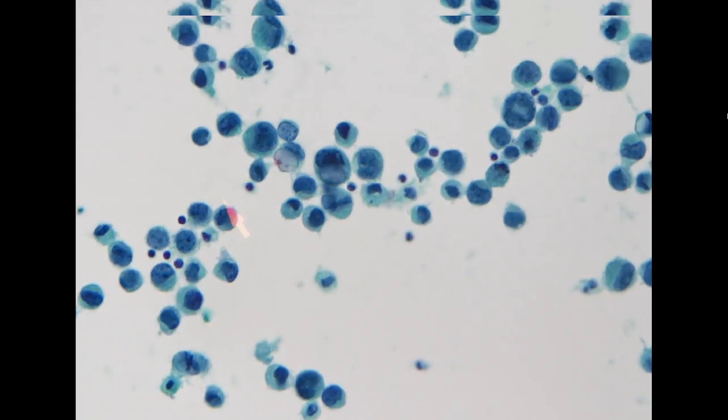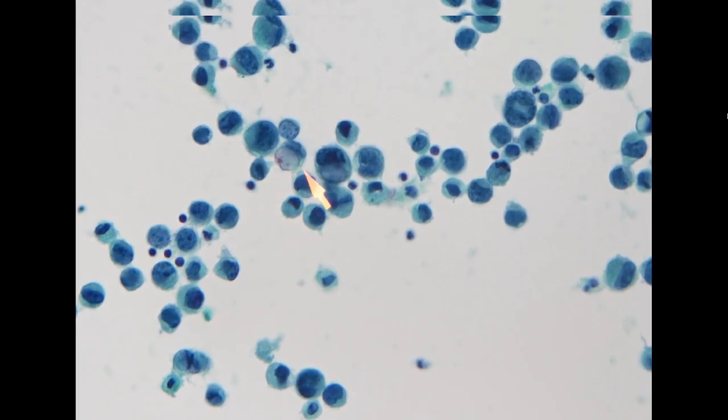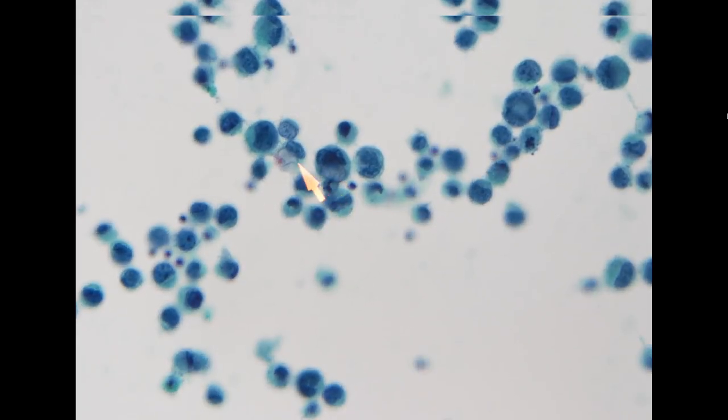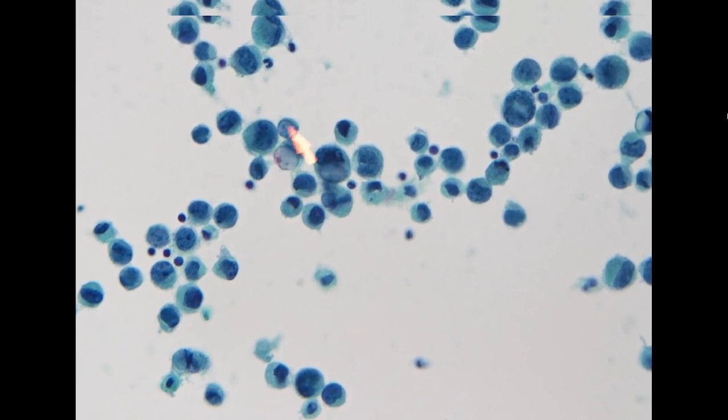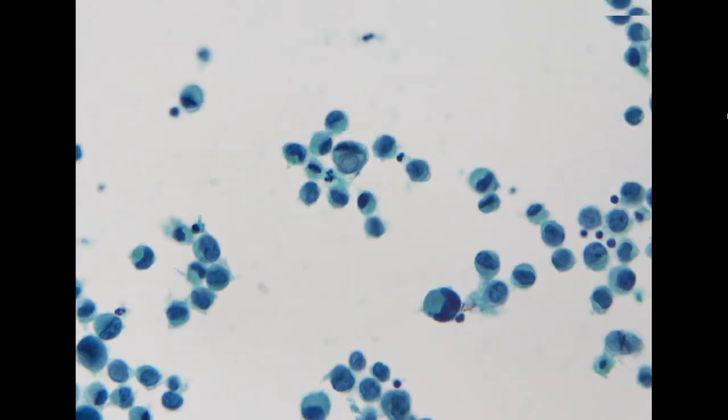So for the gastric signet ring cell carcinoma, usually it would present as individual single cells, and in the cytoplasm you can see mucin. So it is very rare that you can see cytoplasmic mucin in lung cancer, but it is more common that you can see it in metastatic gastric cancer.